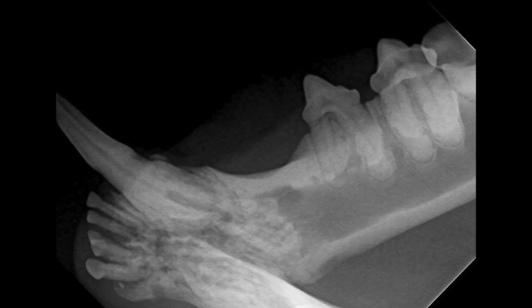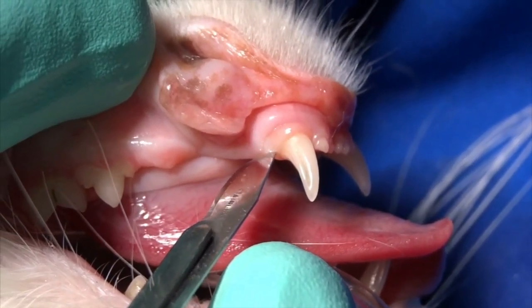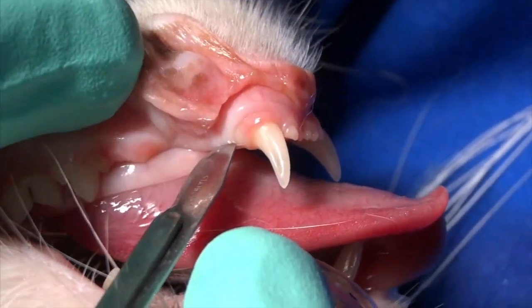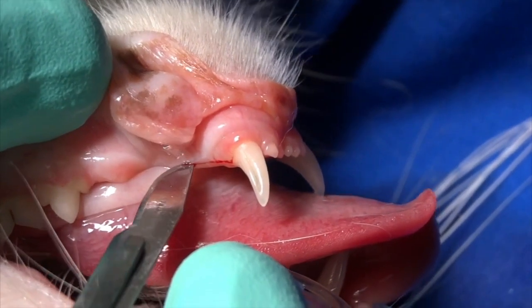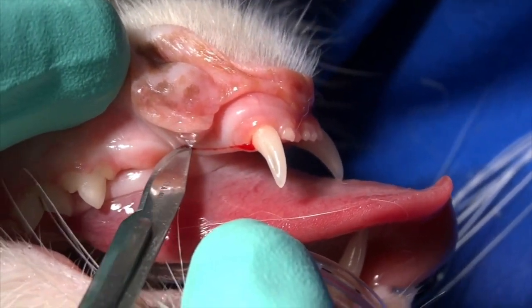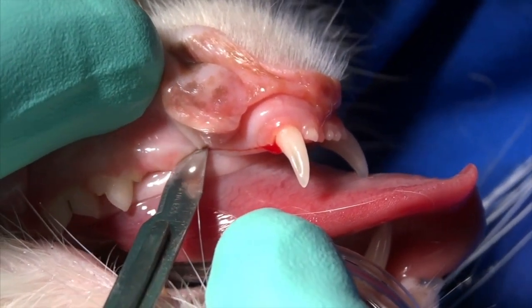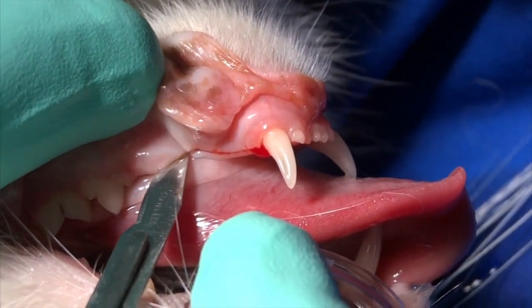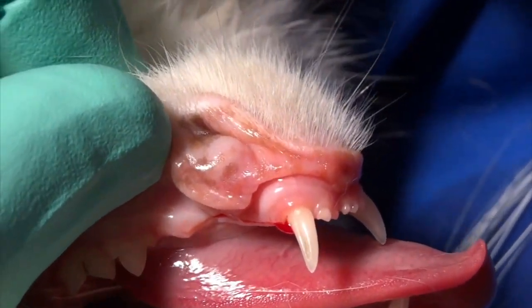This is a very similar radiograph to the tooth that we are going to be extracting here. The approach is exactly the same as we would take to extract a normal mandibular canine tooth affected by periodontal disease or fracture, meaning not tooth resorption.